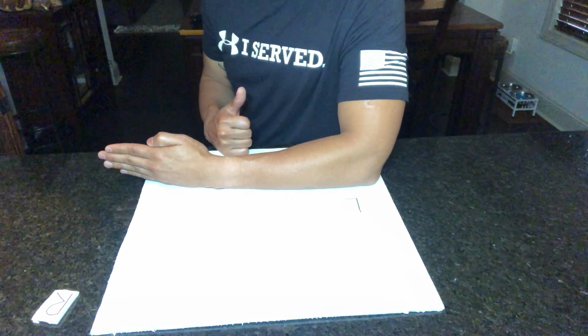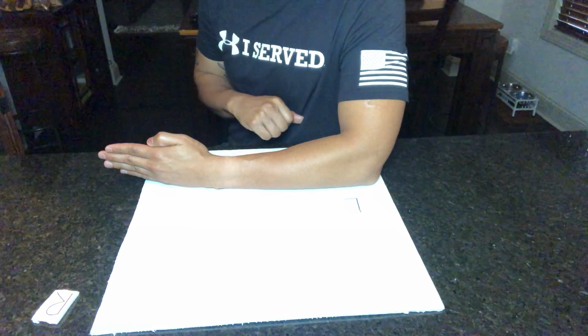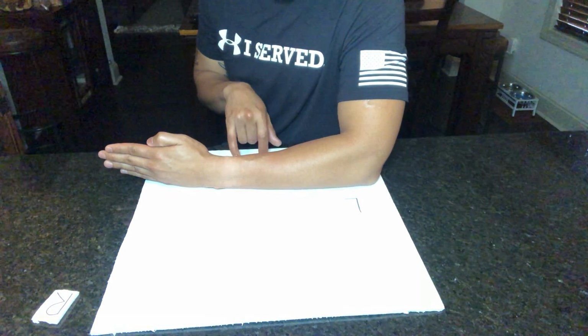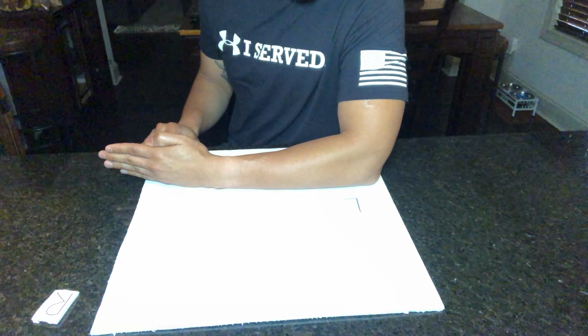So those are our views. Hand views, wrist views, some special wrist views, as well as forearm views. And that concludes the video.